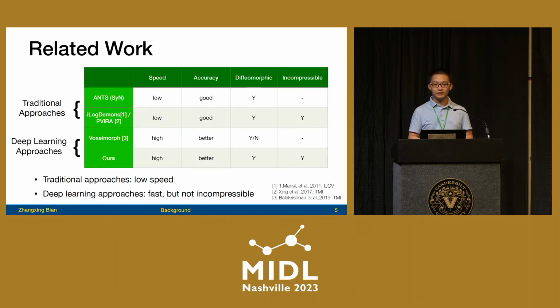Since we framed this tracking problem in a registration framework, there are a lot of registration algorithms out there that people may be familiar with. For example, the SyN method from the ANTs toolbox, or the iLogDemons and its extension called PVIRA. Those are traditional approaches, and they usually have good accuracy and can achieve diffeomorphic or even incompressible motion estimation, but they usually suffer from low speed.